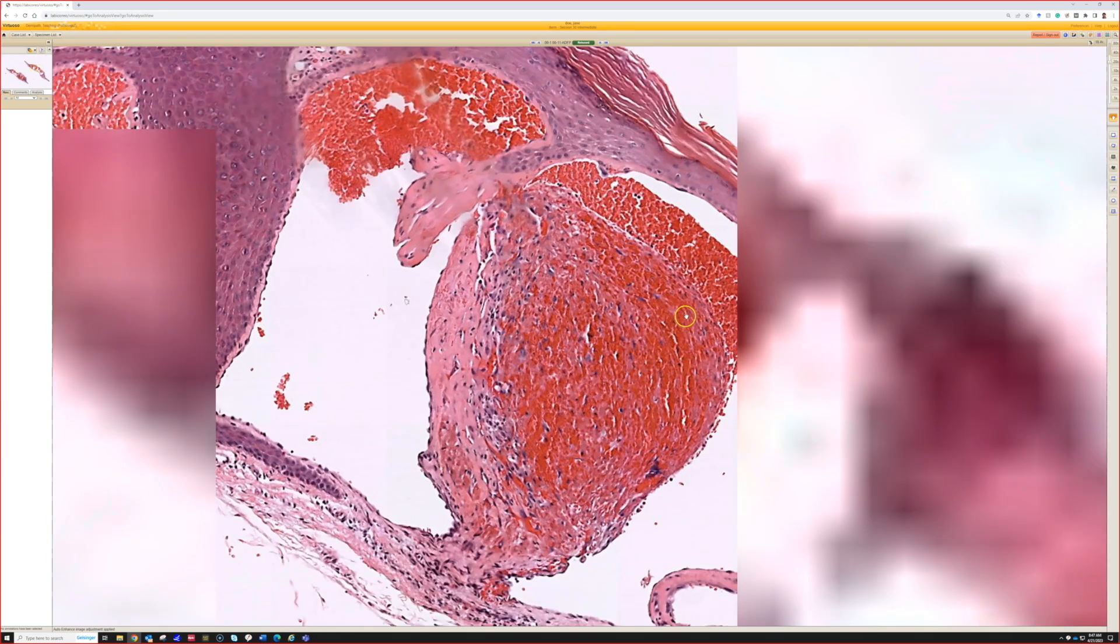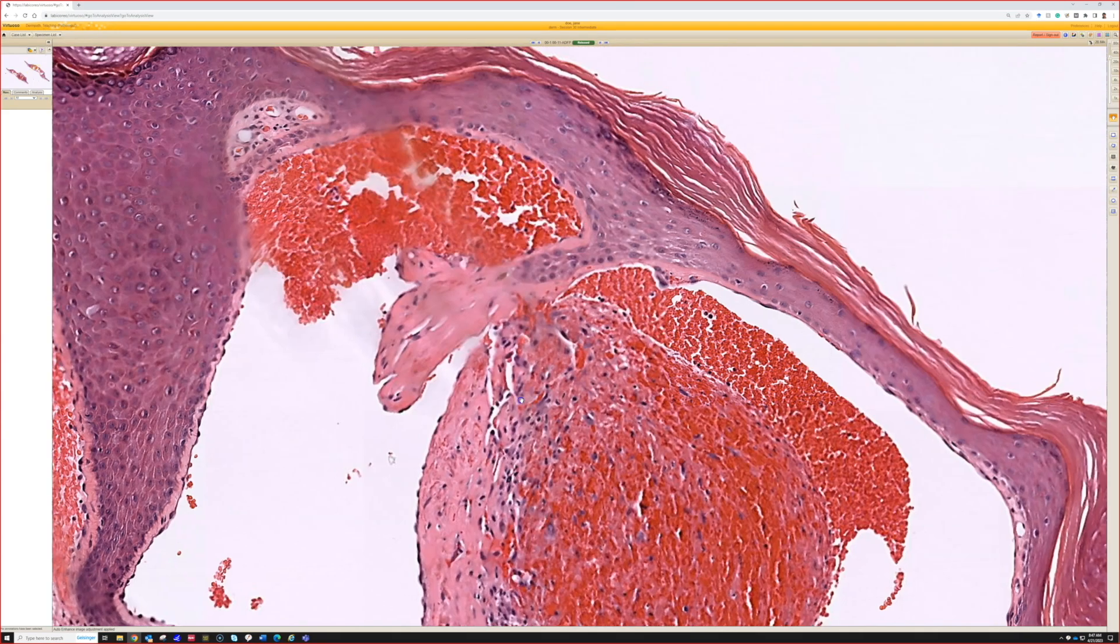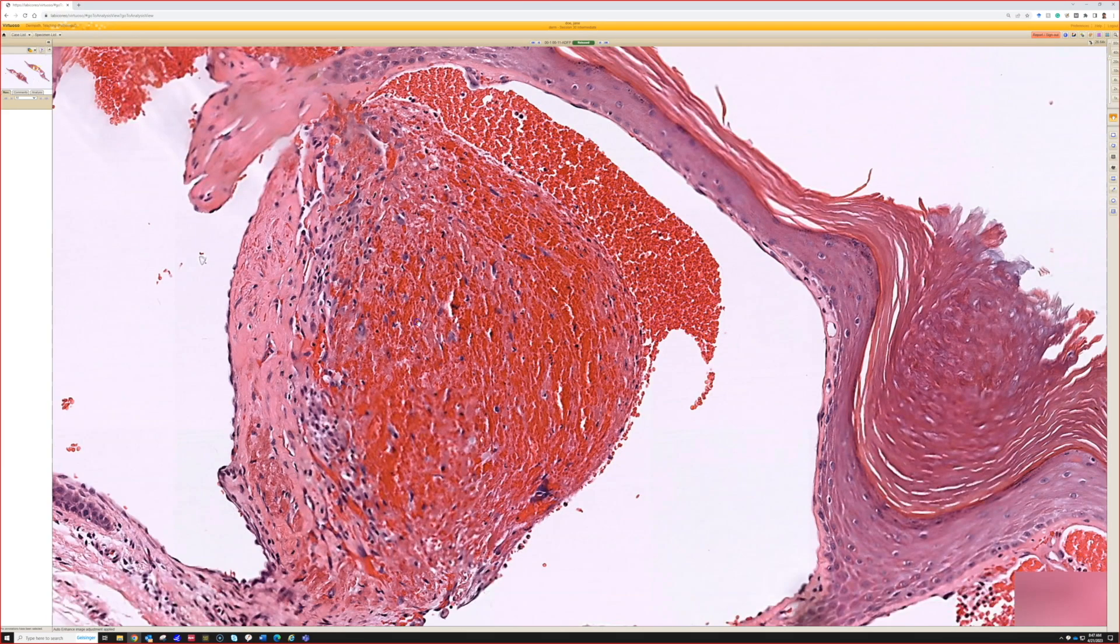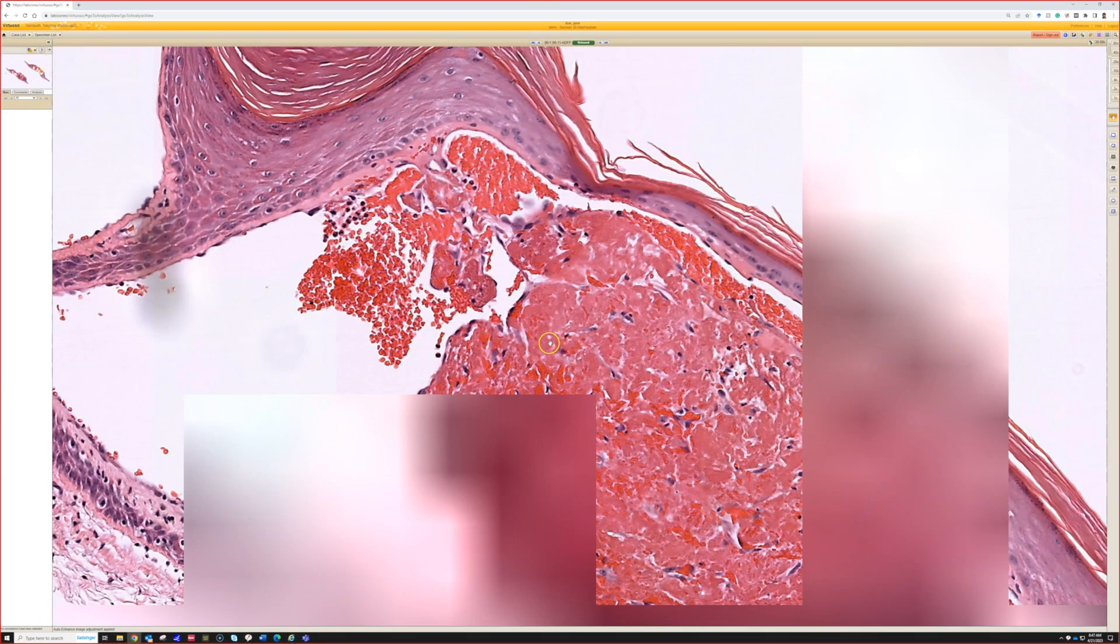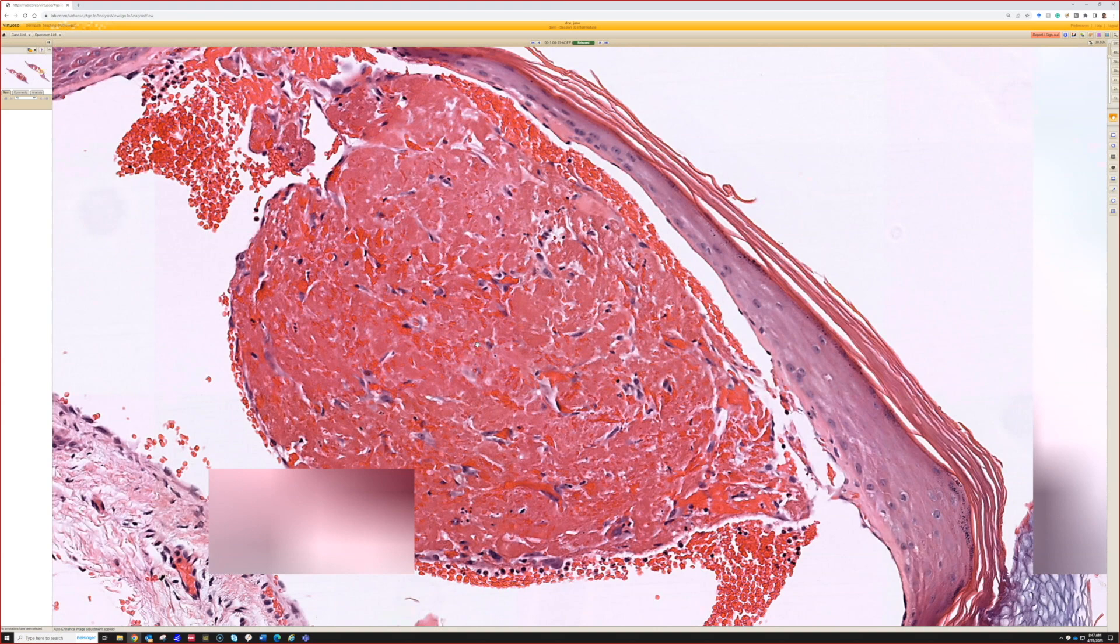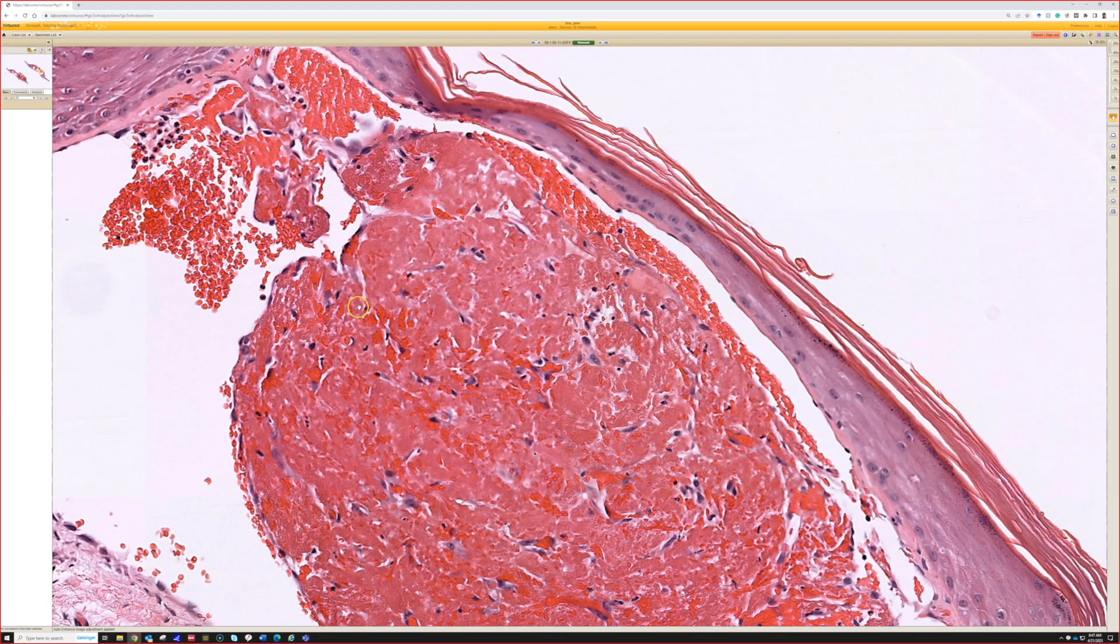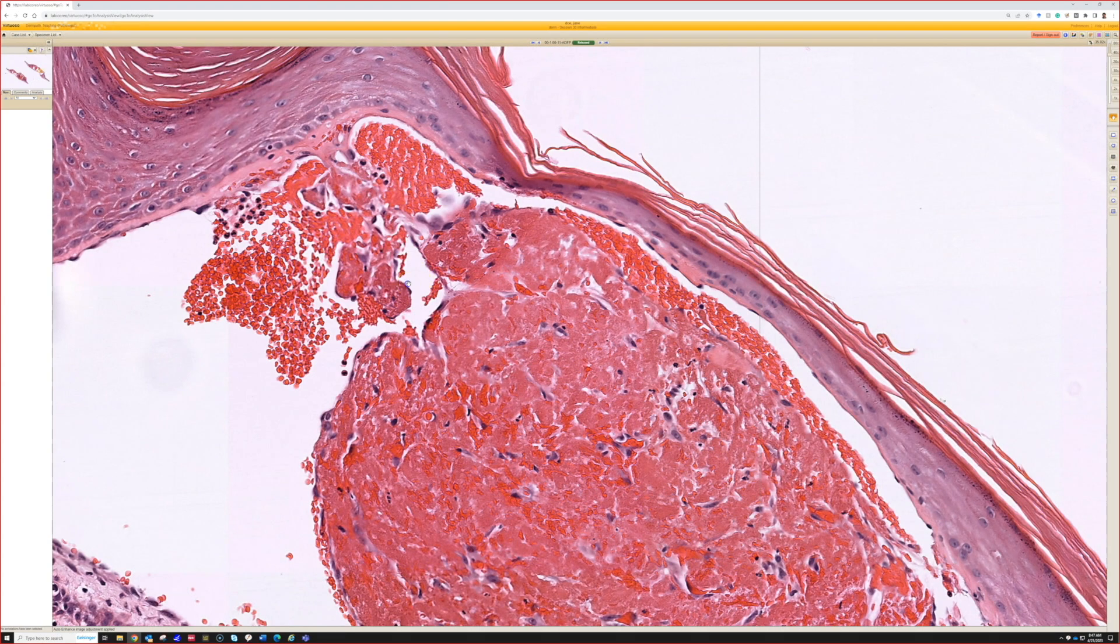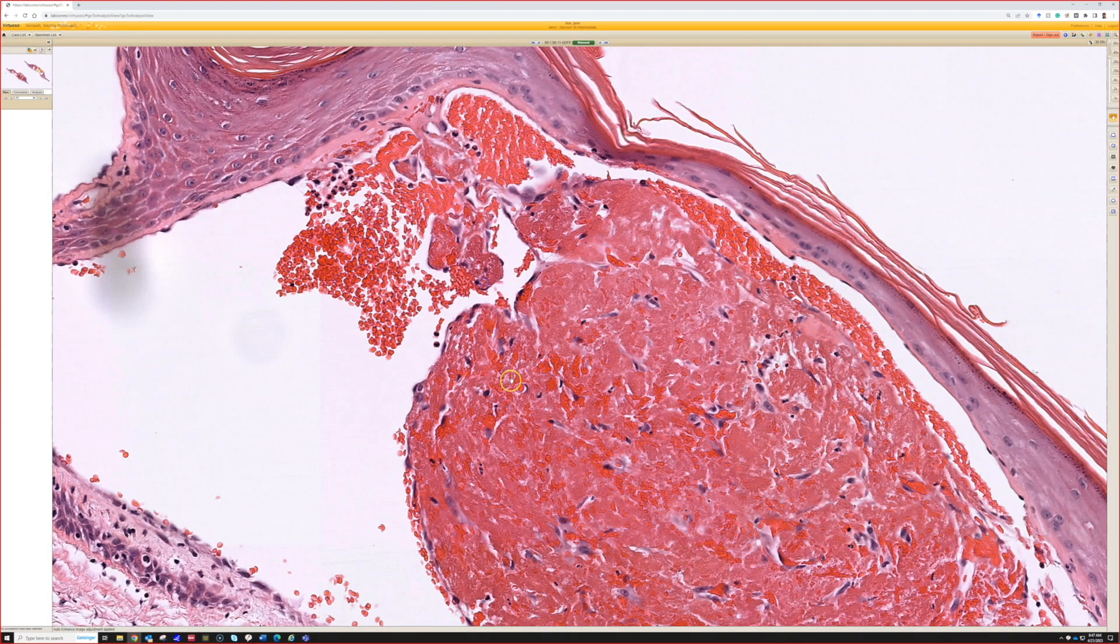Yeah, look, blood and fibrin and it's starting to get recanalized and starting to begin to make some little tiny tufts of papillae. Oh yeah, there you can see it even better over here. So see, this process is always happening. It's just not as florid as that last case. So learning to see it when it's doing this at a subtle level, you can begin to get really comfortable recognizing it. But this is nice, bright reddish pink fibrin and it's wrapping into little tiny papillae here.